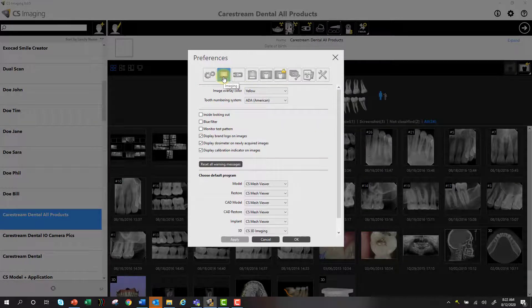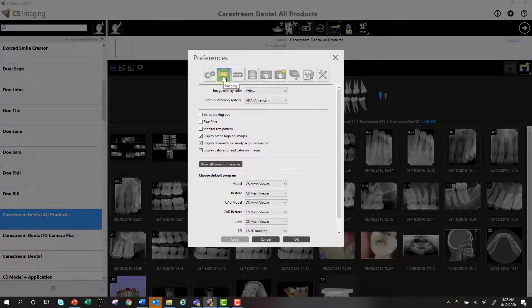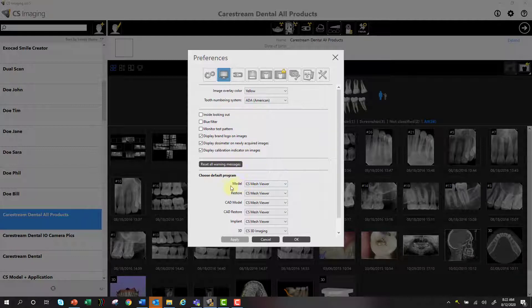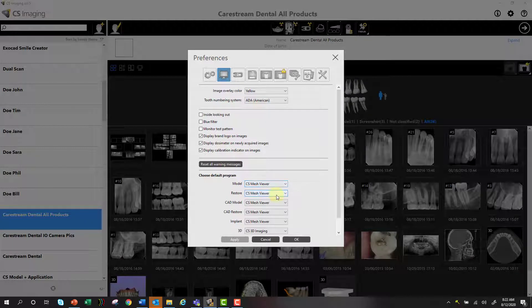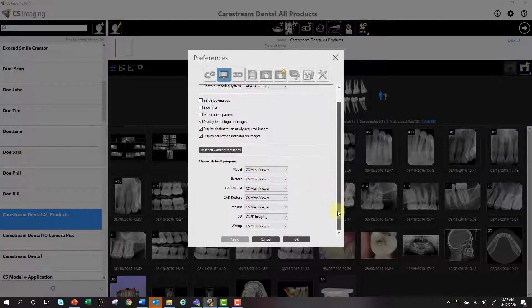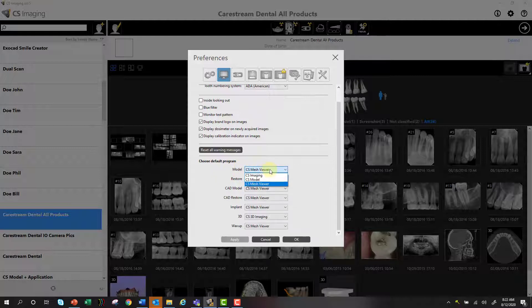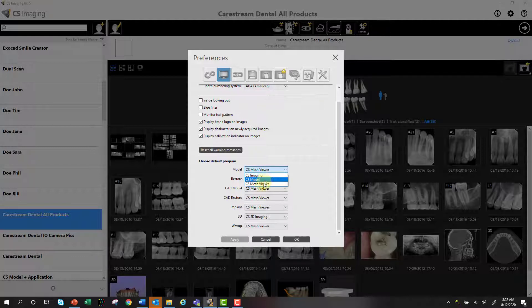The bottom part of this second tab that I'm going to review is really only for customers that have CareStream CBCT and CareStream Digital Impression Scanners. If you don't have that, then it's not going to really apply to you. This is the default program that will be launched when you double click an image. So if it's a model from the CS3600, CS3700, when you double click it, it's going to launch Mesh Viewer. And you can have that default selection to CS Model, CS Mesh Viewer, or CS Imaging. I'll show you what CS Imaging is in a minute.